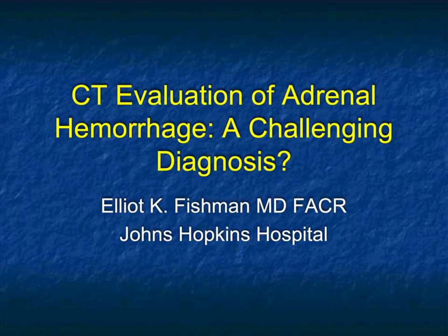And this is going to be on a topic that I think is very challenging, and it's adrenal hemorrhage. I'm going to go through the causes of adrenal hemorrhage. I'm going to go through the CT appearances.